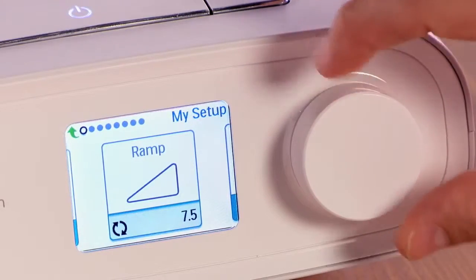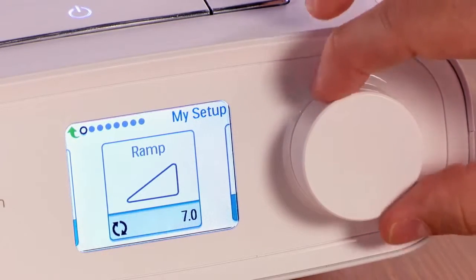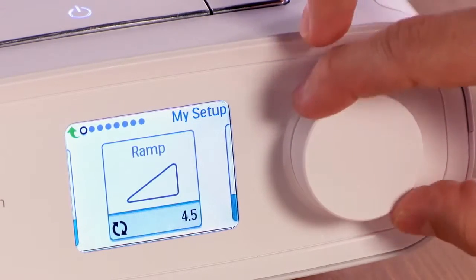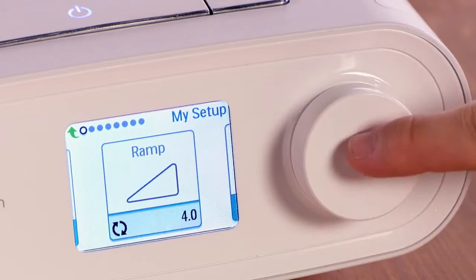Turn the control dial to increase or decrease the ramp start pressure in 0.5 cm increments. Push the control dial to save the change.